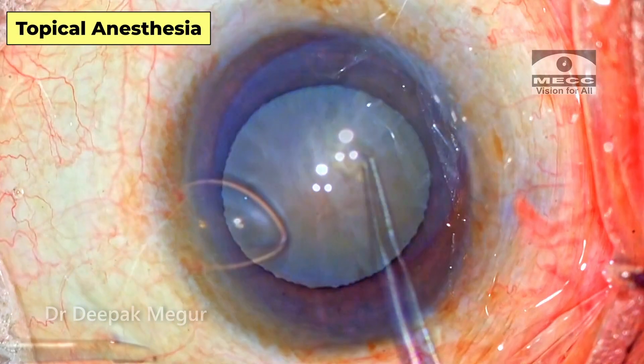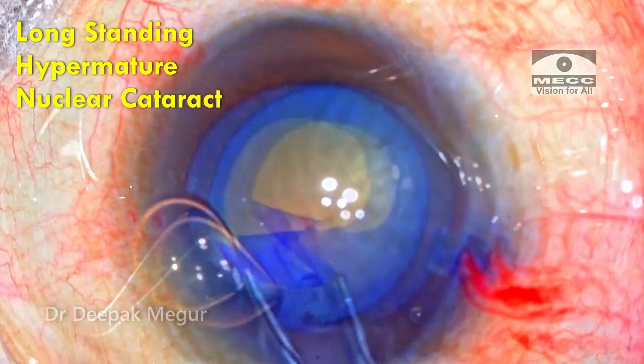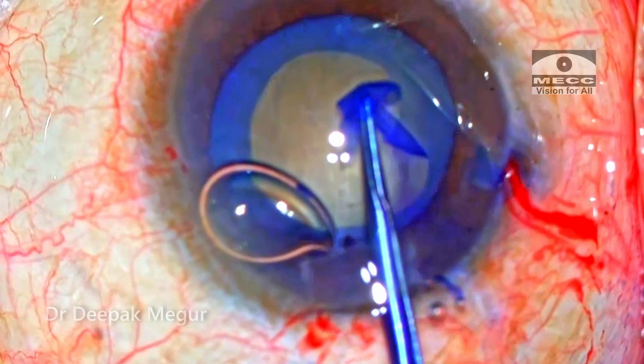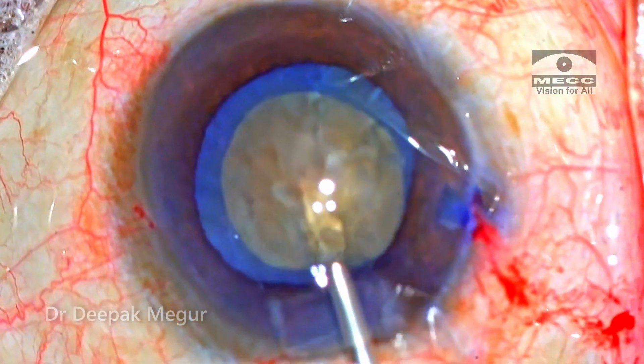Welcome back to another interesting case. This is a 60-year-old gentleman who has got a long-standing hyper-mature nuclear cataract. The other eye is pseudophakic and I operated on that eye about six to seven years back.